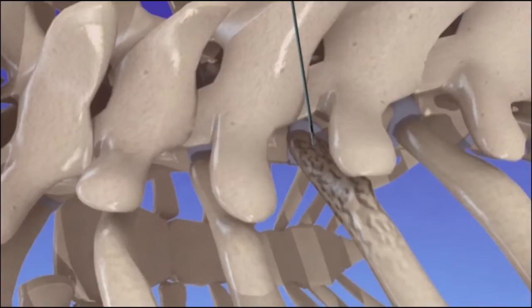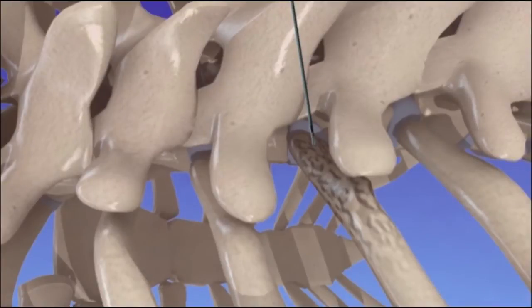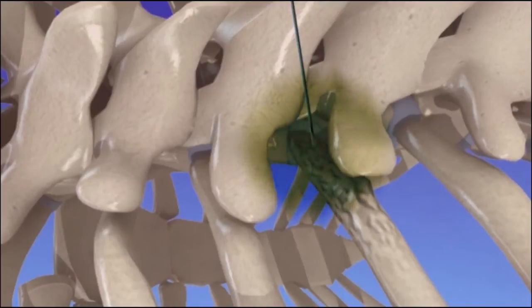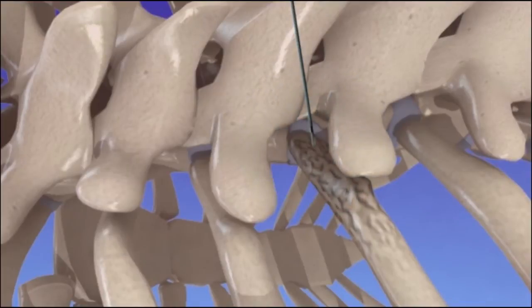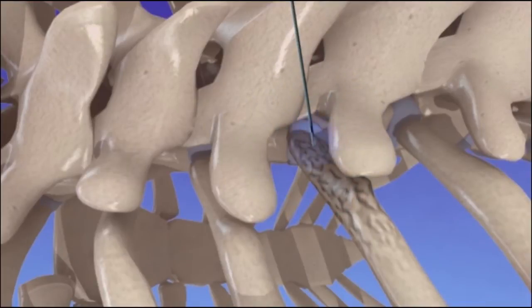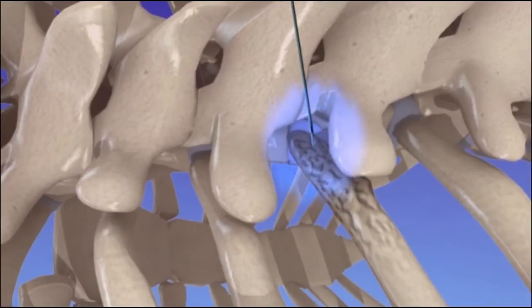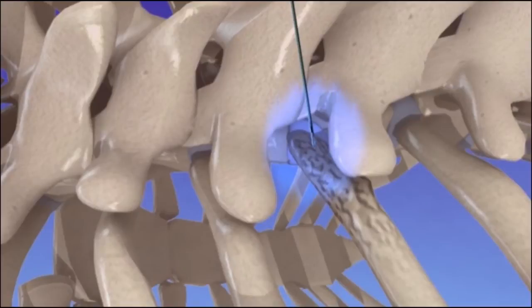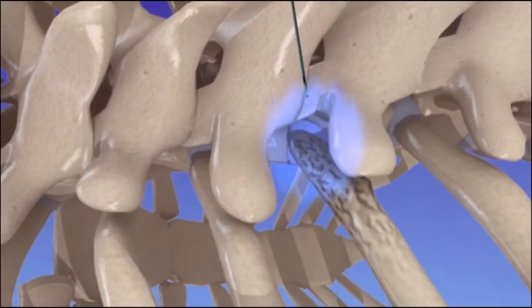A contrast dye is used to confirm the needle placement. Next, the medication solution is delivered to the costovertebral joint. The needle is then removed.